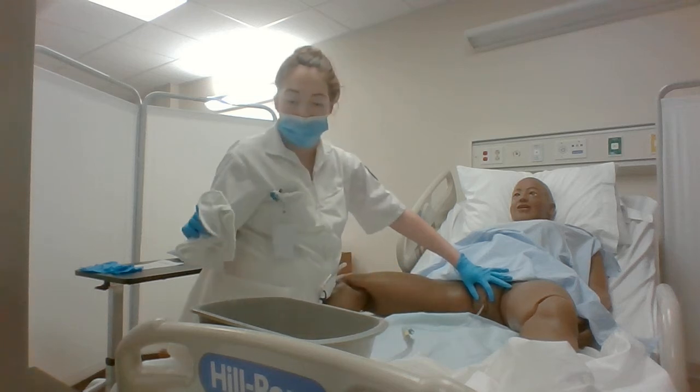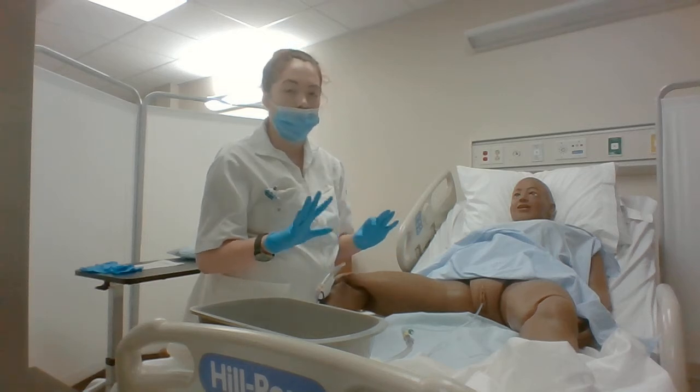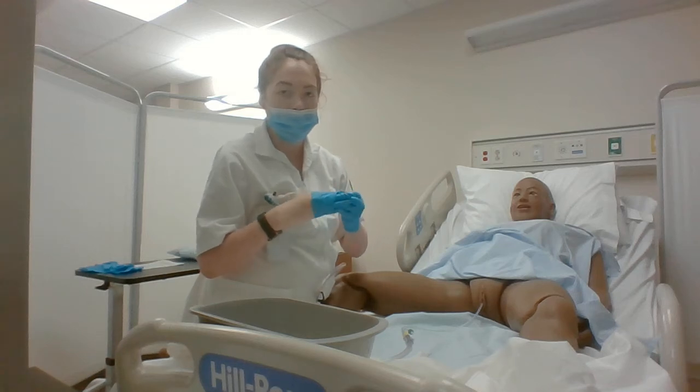And then I would rinse everything, and then I would discard all of my dirty equipment, and I would take off my gloves and wash my hands.